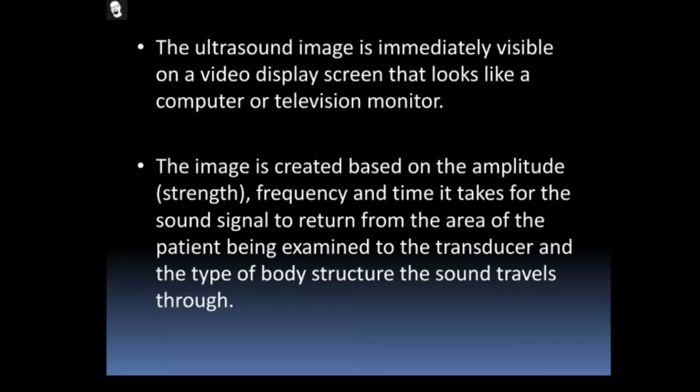That is just the sound waves. The sound waves are not predictable to show on the monitor. Through using those sound waves, we are using some computerized software behind that. That software uses reconstruction and back propagation. That software is responsible for converting the sound waves into a monitor image. All these things happen in a fraction of a second.